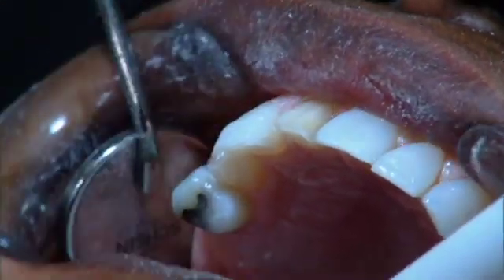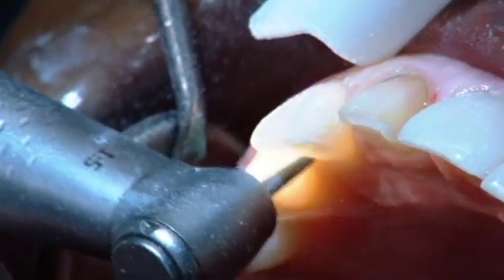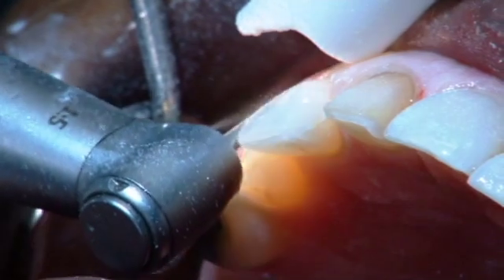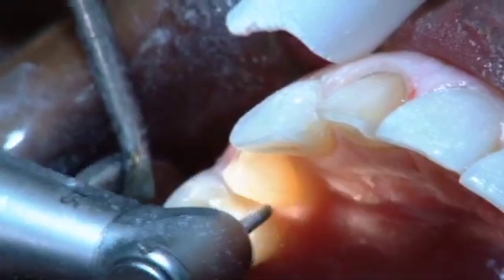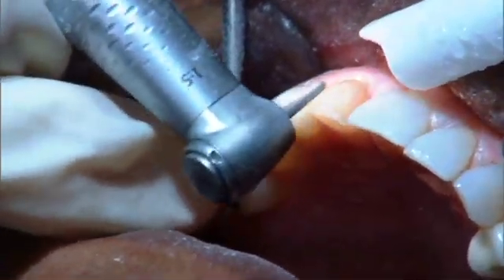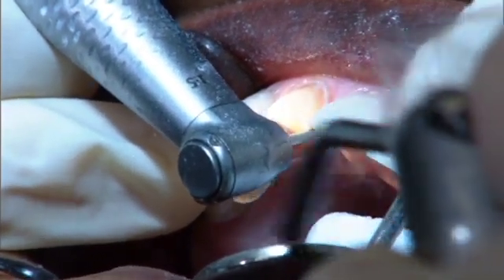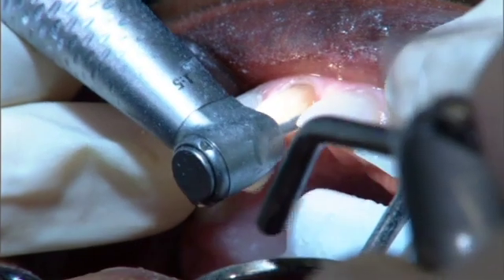We can jump back to our canine now. Do the same process. I'm not so worried about the adjacent teeth as I break my contacts, just because they're going to be removed. But it is nice to keep them there as a reference. With the labial surface reduced now, we'll be able to jump to the lingual surface and carry that margin all the way around at the gingival.